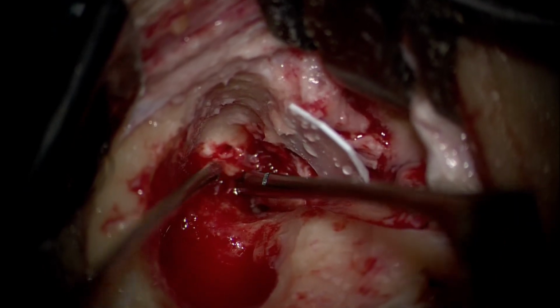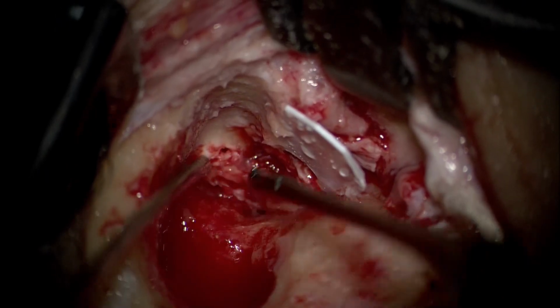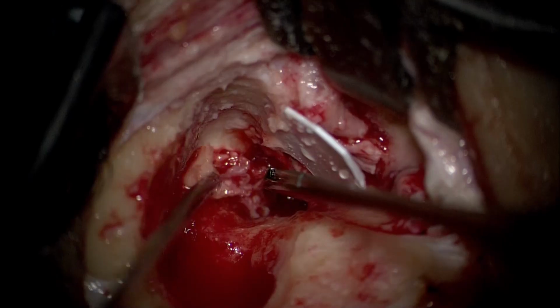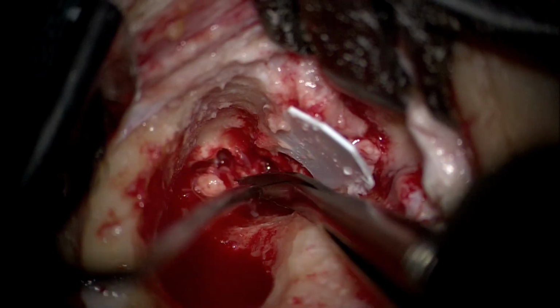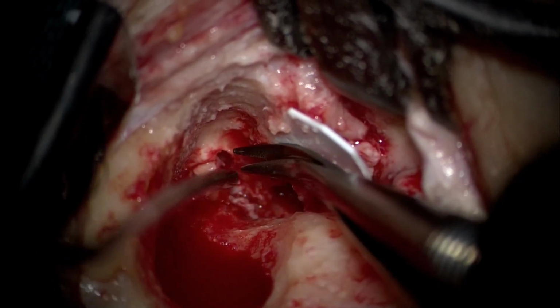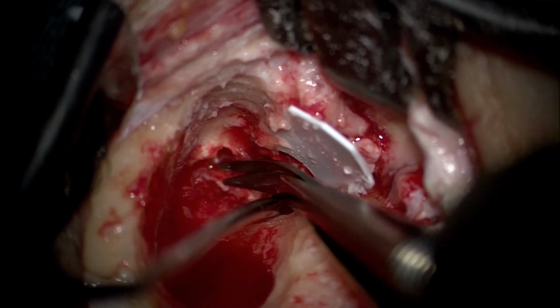areas. Also, a bone of contention always is the anterior epitympanic space, which we see very often not being opened adequately and thus always becomes a hidden point in the postoperative period, thus leading to recurrent cholesteatoma. So it's very, very important and imperative to open the anterior epitympanic recess widely in all canal wall down mastoidectomy cases. Without that, the surgery is really not complete.